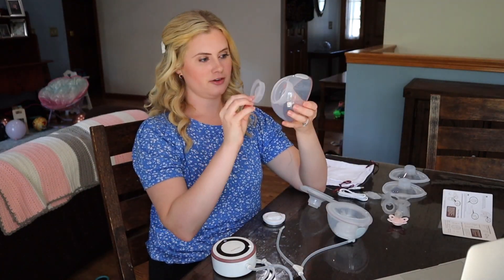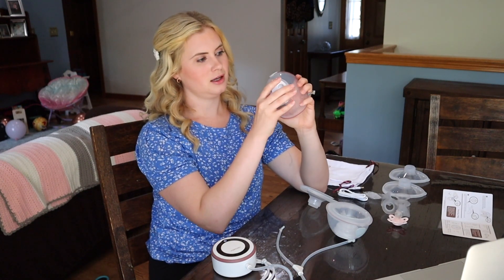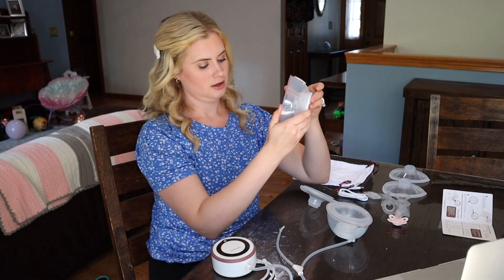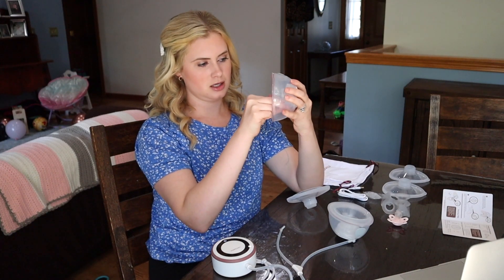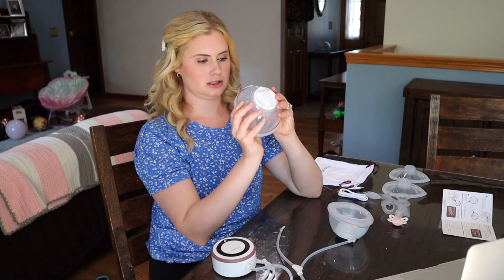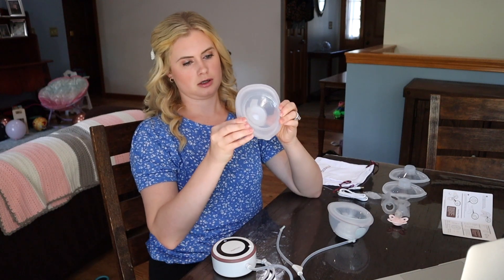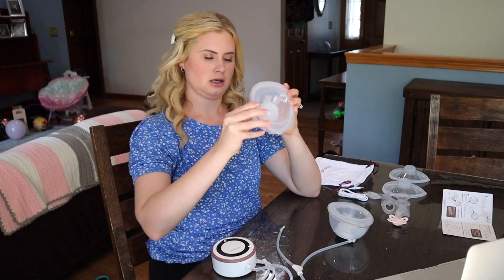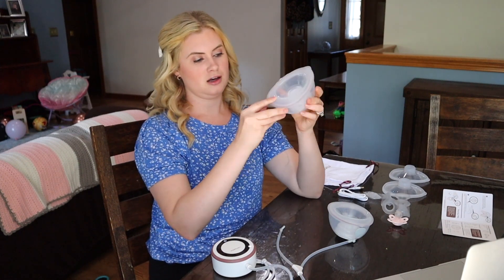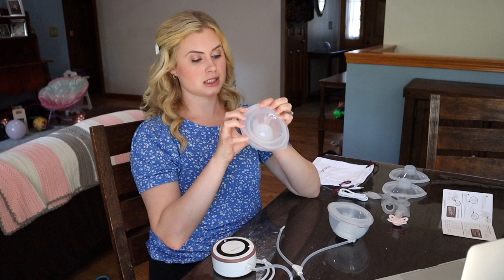Let's talk assembly. Take your diaphragm and place it in — it just slides right in. Grab the top, put it in with the hole at the top. Grab your duckbill and put it in. Then grab your phalange — it is a double-sealed phalange, which I love, very unlikely to leak, but you do have to take care when putting it on. Go all the way around and make sure the double seal is really on there. If it's not on well, you're going to leak milk. I really like how few parts it has. Then take your tubing and slide it on. Now it's a pump.